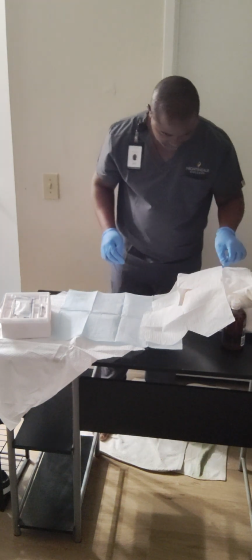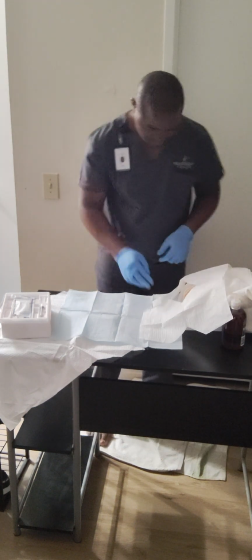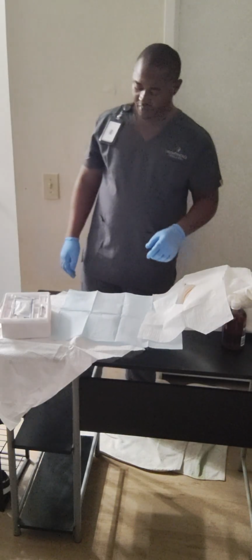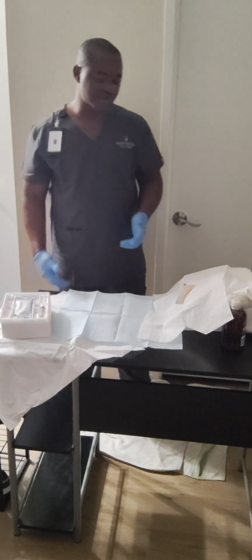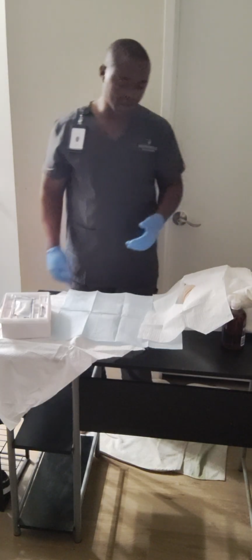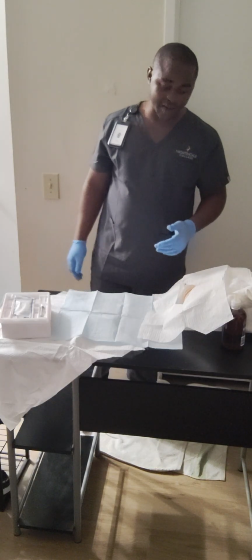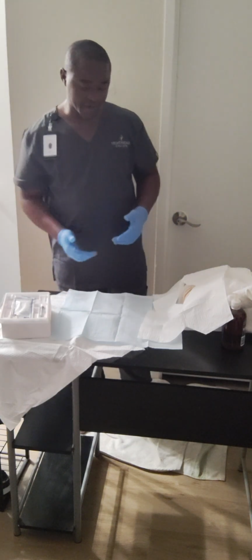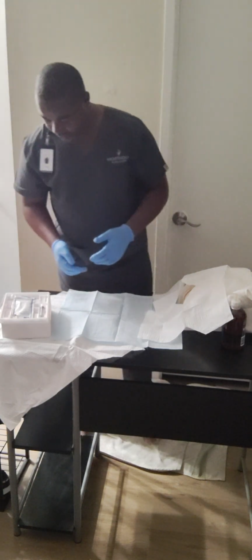I have my dressing on the patient. So at this time I'm going to advise my patient that it is very important that they don't move as I'm going to start working on them, in order for me not to break my sterile area. This is my kit. I'm going to move it back, arrange it towards me, staying in that sterile field.